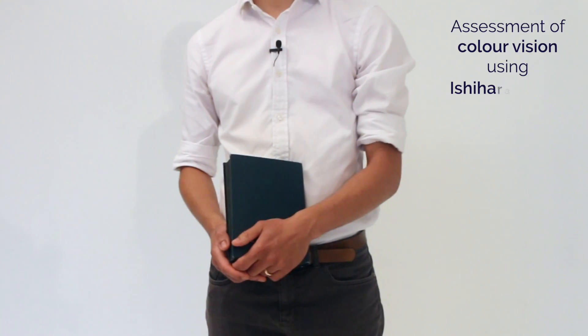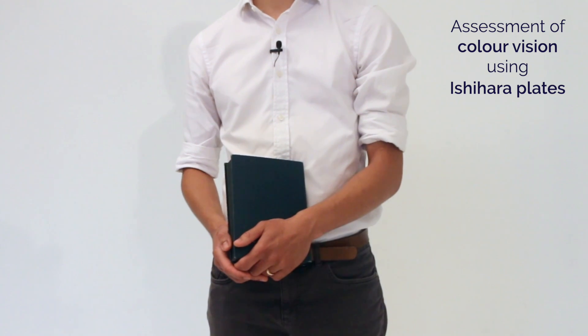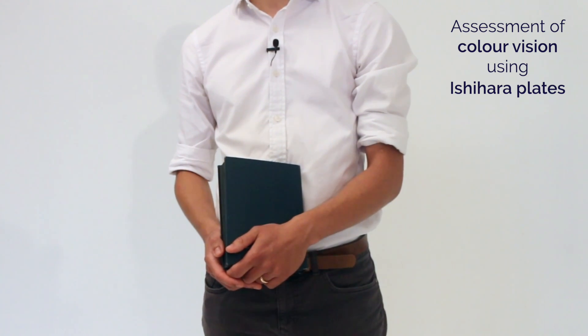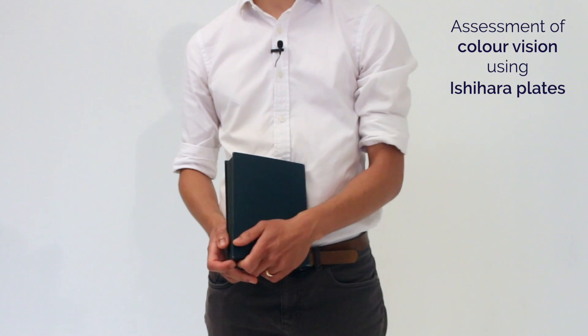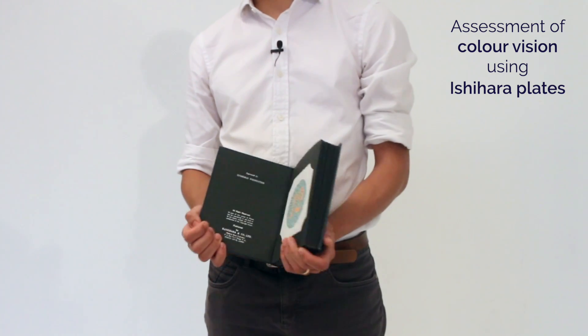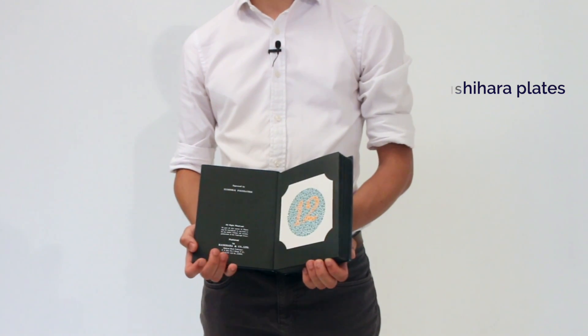Okay Grace, I'm going to now test your colour vision. We're going to test one eye at a time again. If you could cover up your left eye for me please. And if you could read the number that you see there.